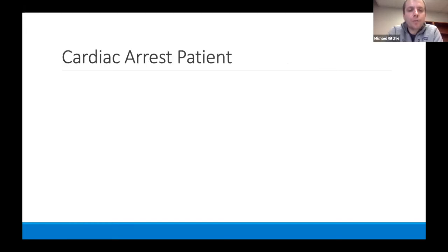Cardiac arrest patients are really controversial. If you start getting a lot of VAD patients in your hospital, or you go to a place that has a lot of VAD patients that come in the ED, it's really important that you work with the VAD coordinators and VAD team on whether or not they would want you to do CPR. A lot of VAD programs will say, don't do CPR. Try to just do chemical coding.